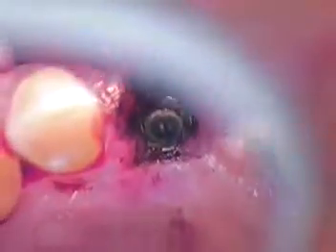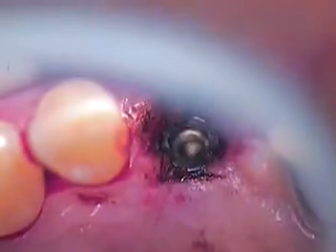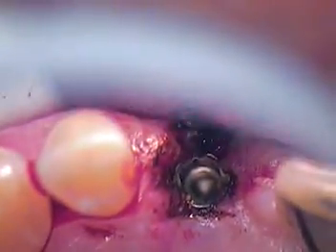Okay. Threads look clean. That's good news. So the object of the game is to get a positive seat. All right. Now cavity cleanser, we'll dip that. You can see some of this tissue starting to collapse a little bit now, so we're going to kind of march along here.